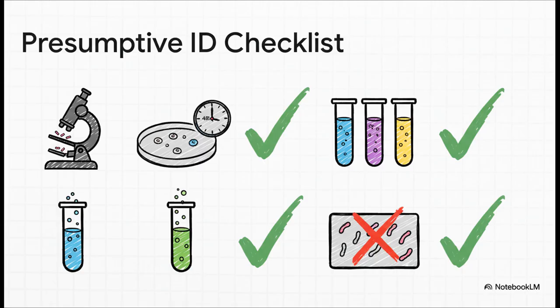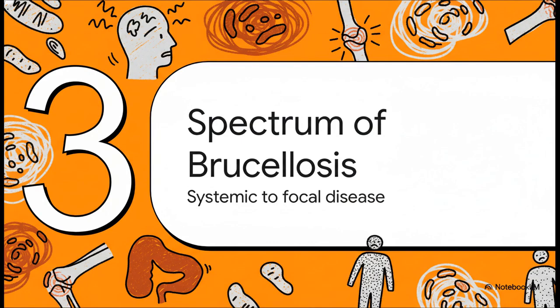You see tiny, faint, gram-negative coccobacilli. It's a slow grower, and it's oxidase positive, catalase positive, and here's the big one, it's rapidly urease positive, like under 2 hours. If you see that combo, you don't ask questions. You treat it as Brucella until a reference lab tells you otherwise. Full stop. Okay, so we've seen how tricky it is in the lab.